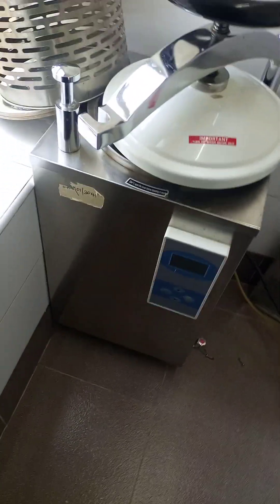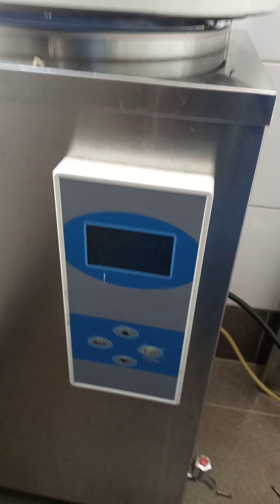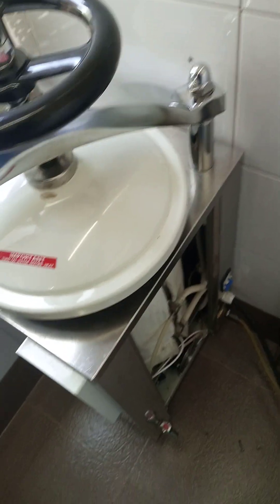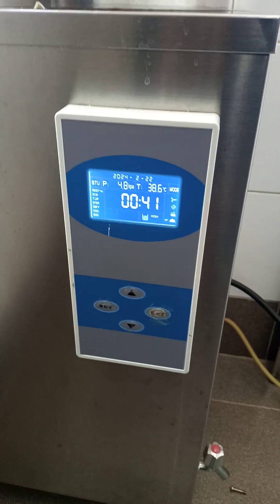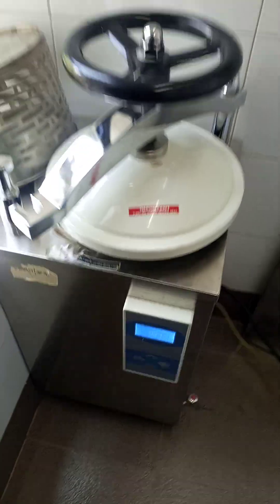Hello, today we shall look at the autoclave. We have one here, it's a ULS 35 HD. I have two of these — this one is functional, it works pretty well, and then I have another one over here which is the one I'm trying to work on.